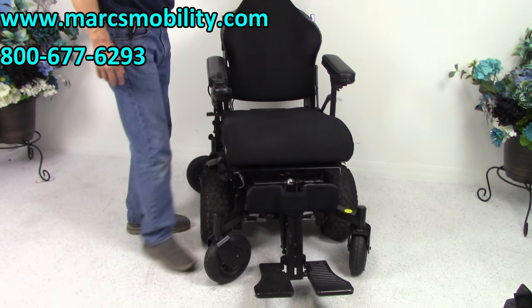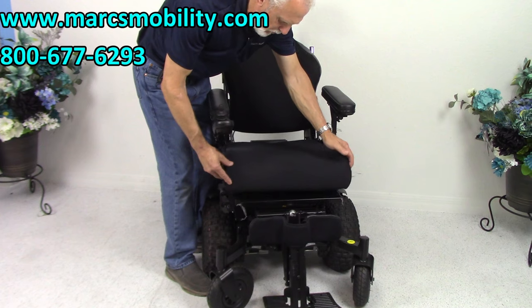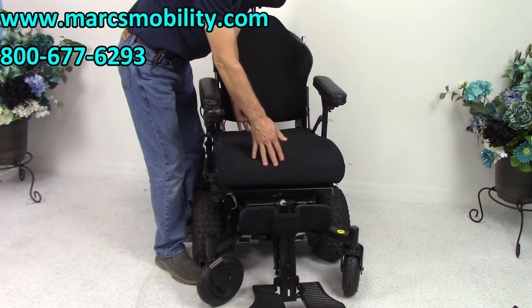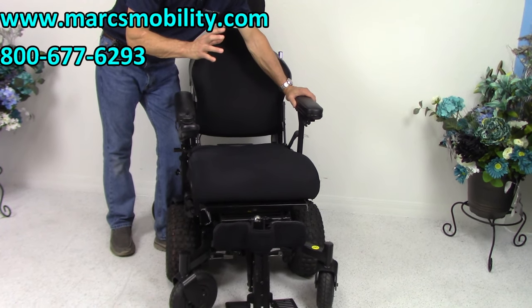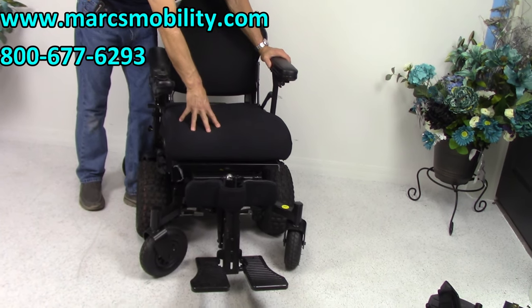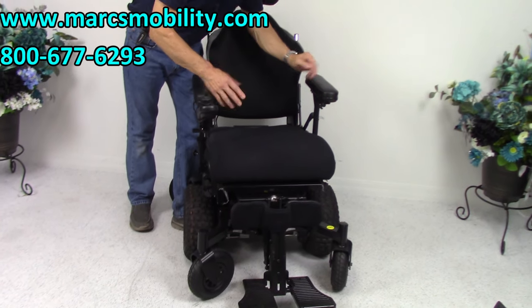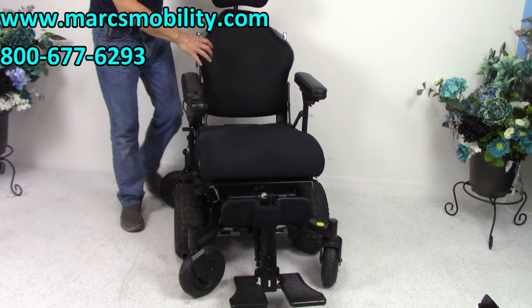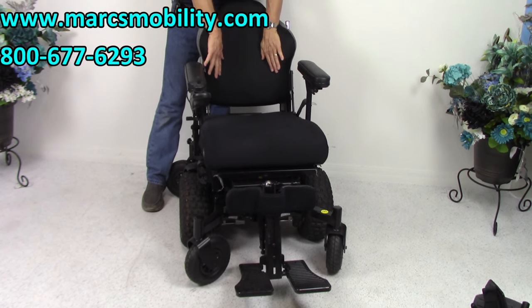Let's look at the seat on this chair. The seat is 20 inches wide by 22 inches deep — it's a large seat. I cannot change the seat on this chair, so if you're going to buy it, this is what you're getting: 20 wide by 22 deep. This is a contoured back, so when you're sitting in here you're well contoured and staying in one position.